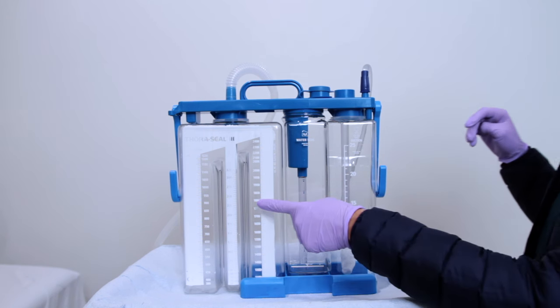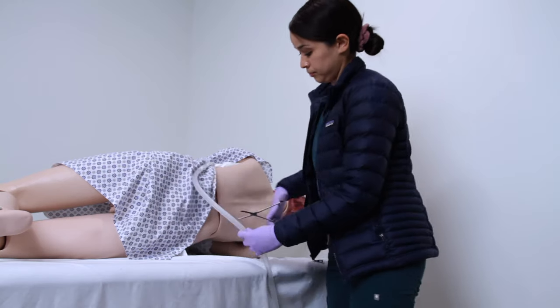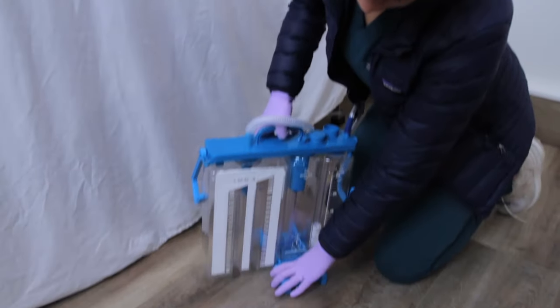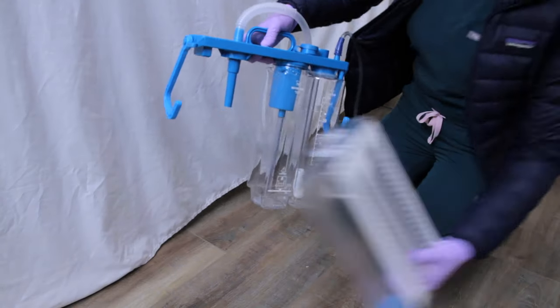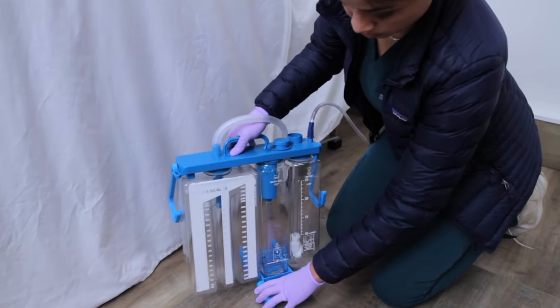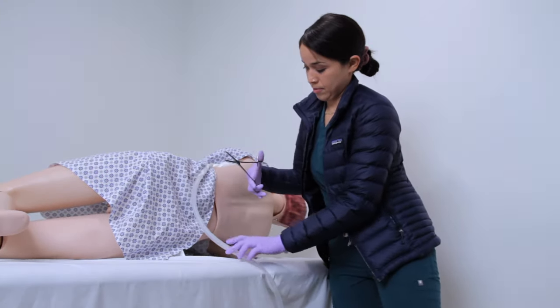Now let's talk about the collection drainage unit. The chamber is replaceable and can be removed with physician approval. You want to temporarily clamp the drainage tube from the thoracic catheter — you can use the clamp attached to the tube or Kelly clamps. This will prevent fluid from entering the collection chamber unit. You will then take off the blue safety guard, referred to as the floor stand, and twist the chamber clockwise and pull down gently using universal precautions. Then insert the new collection chamber and rotate counterclockwise.